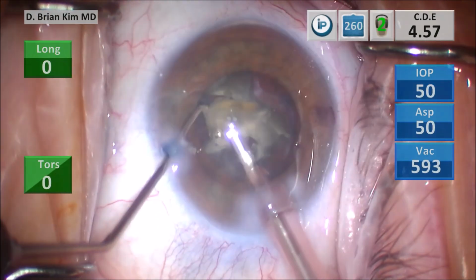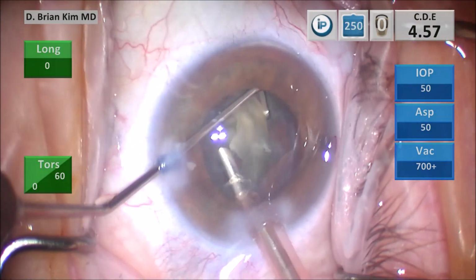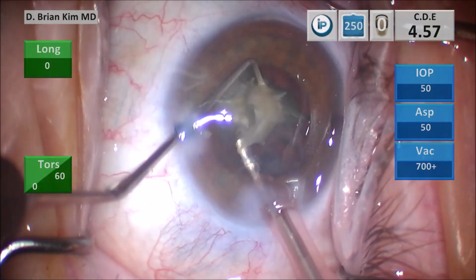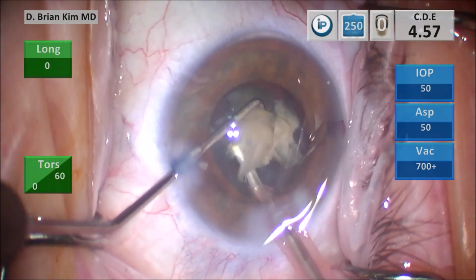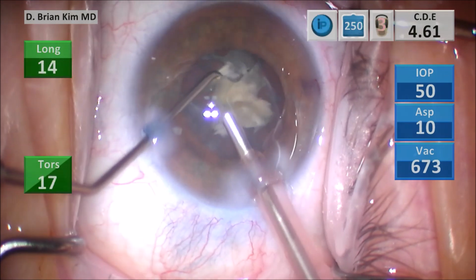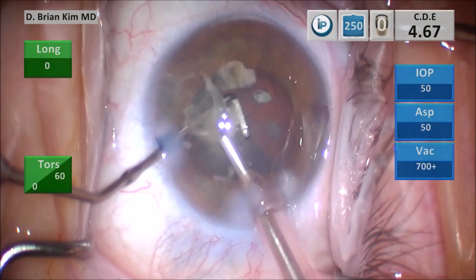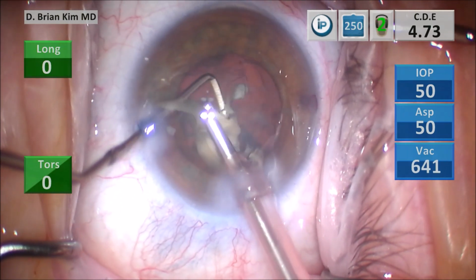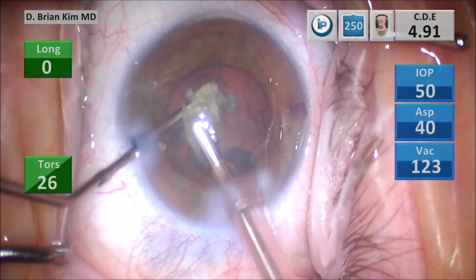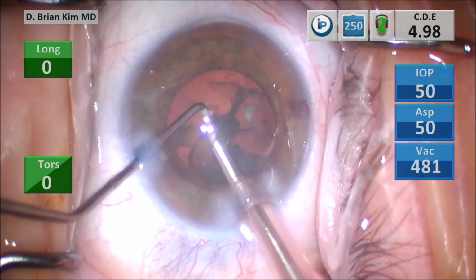And that's why it really just gives me a lot of confidence to maneuver these instruments in the bag, even though I'm closer to the capsule, but I'm able to confidently manipulate the lens pieces and crush the lens pieces into smaller and smaller pieces, pull pieces up out of the bag, and emulsify the lens pieces. So you can see I was able to carefully break up those remaining pieces, and now that was the final fragment there. I'm removing the epinuclear material now.